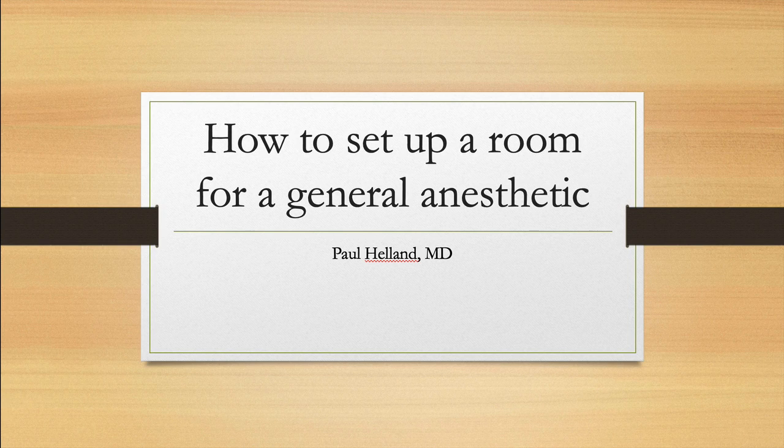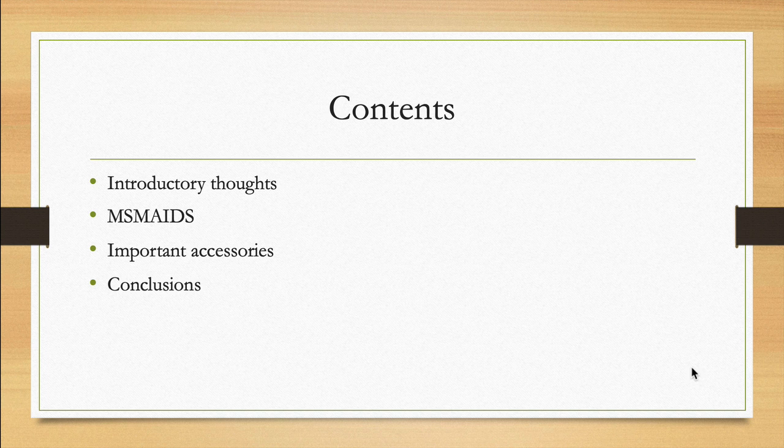I'm one of the anesthesiology residents here at UCLA Medical Center, and today I'd like to go over how to set a room up for a general anesthetic, a question that we often get from our awesome rotating medical students. Just like previous videos, the contents are going to include some introductory thoughts, an acronym that we use to set up a room called MSMAIDS, some important accessories to consider, and some conclusions.